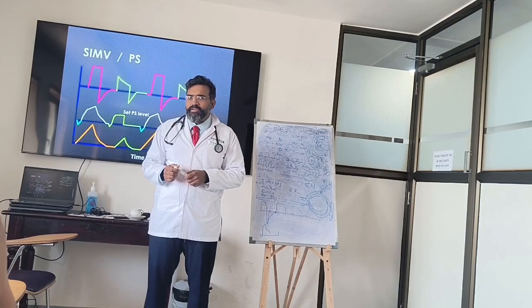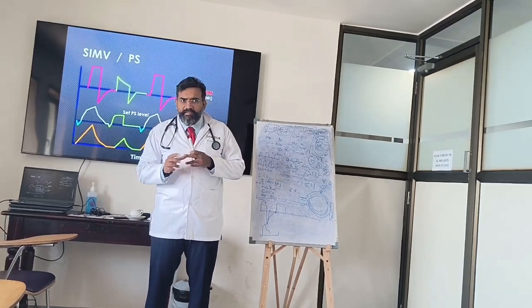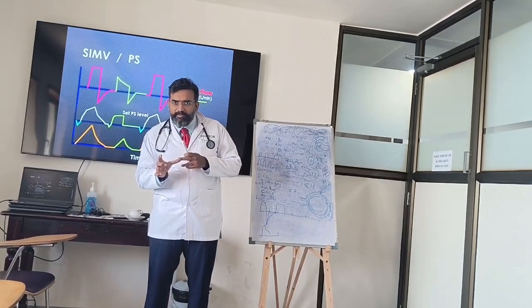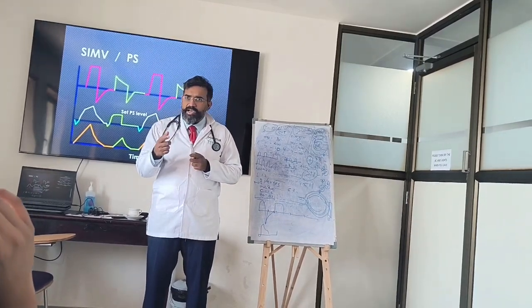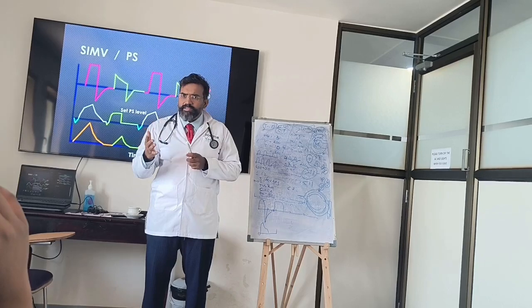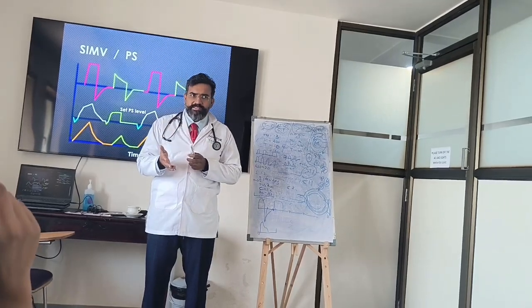You understand? It will not give it. But in that other window, it will wait for the patient to give the breath and it will support that breath. There's a difference. In assist control, what happens? Every breath that the patient takes, the ventilator assists.